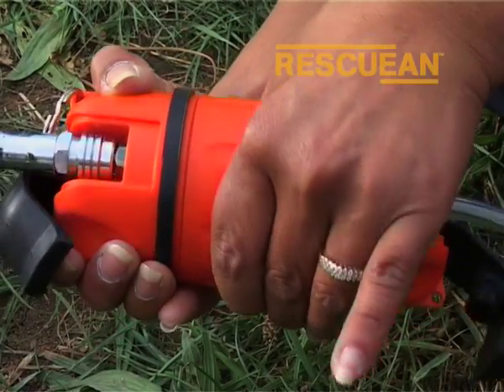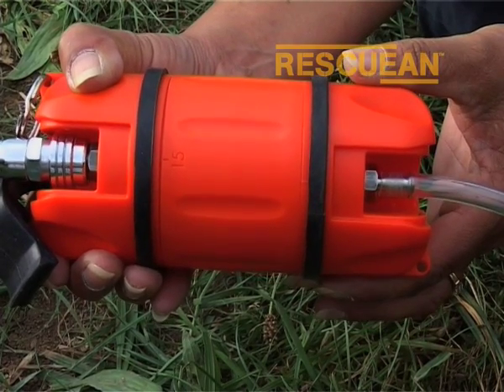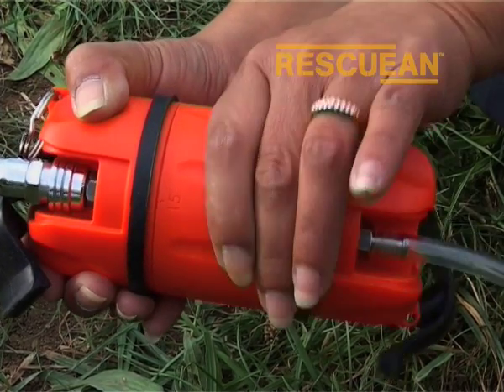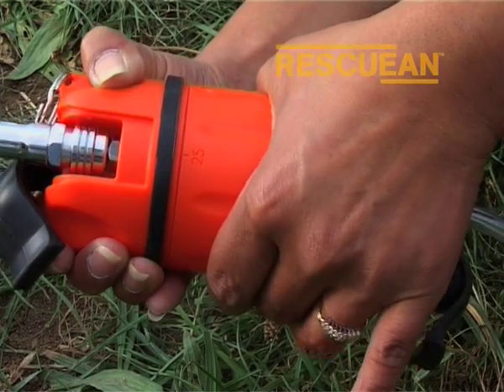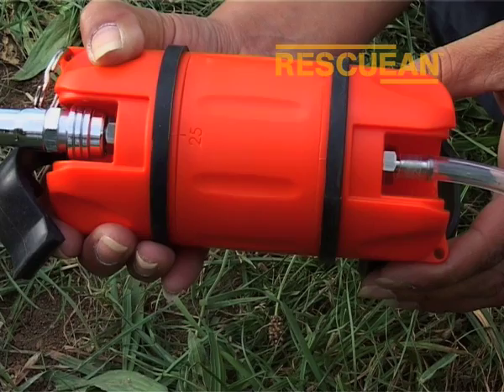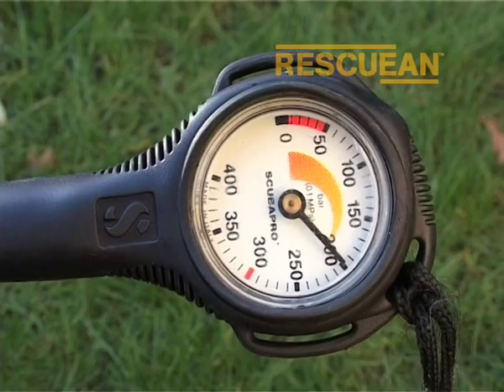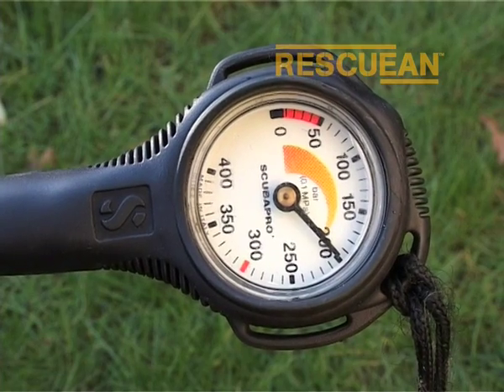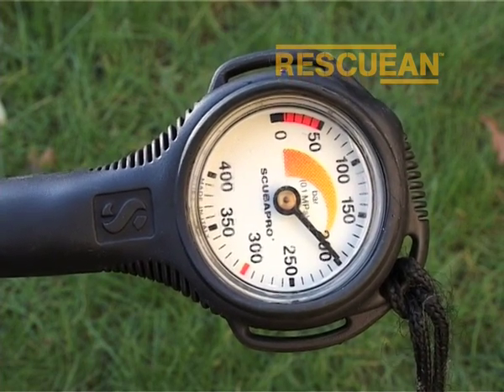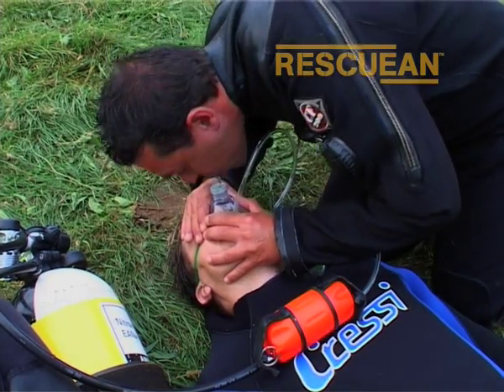The pod's centre twists to obtain either the 15 litres per minute or 25 litres per minute flow rate. You can monitor the cylinder's remaining nitrox by using the pressure gauge on the high pressure hose. Then commence or recommence EFR mouth-to-mask rescue breaths.